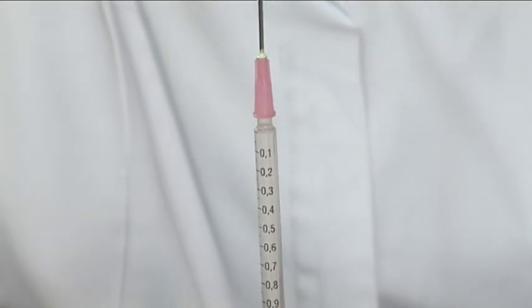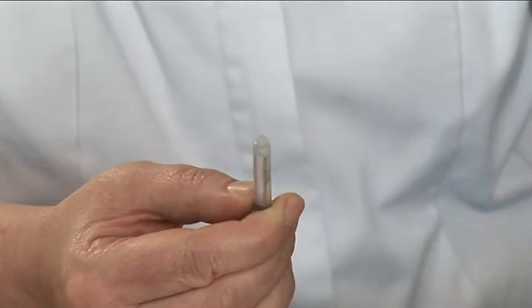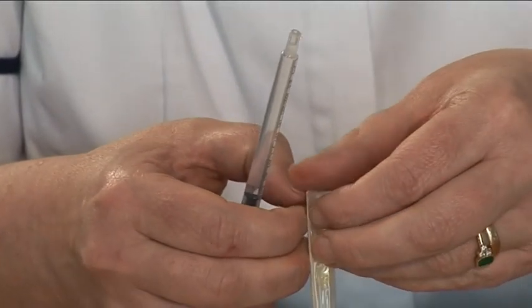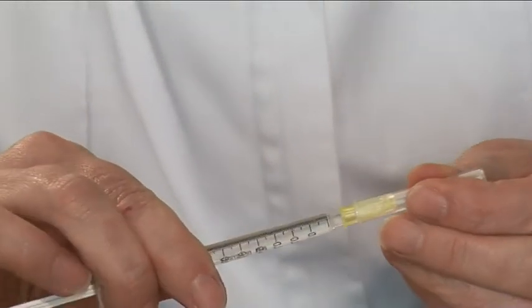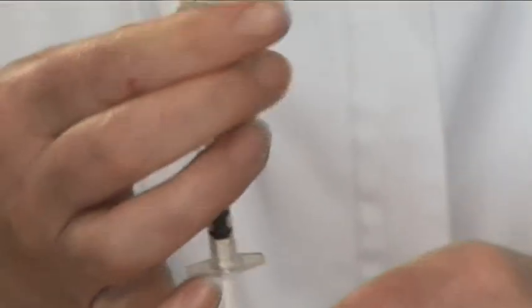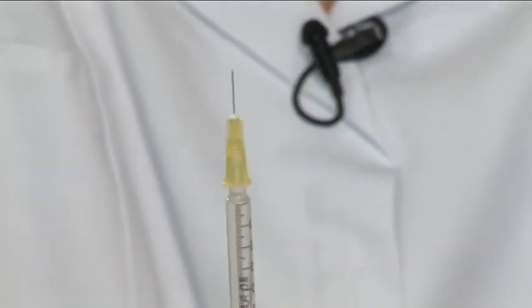Once you have mixed the drug, pull the pink needle off and dispose of it in your sharps bin. Take the small yellow needle, peel the packet back, firmly fix the yellow needle onto your syringe, pull the protective cap off it, and you're ready to inject. Your clinic will have advised you of the best site in which to inject these drugs.